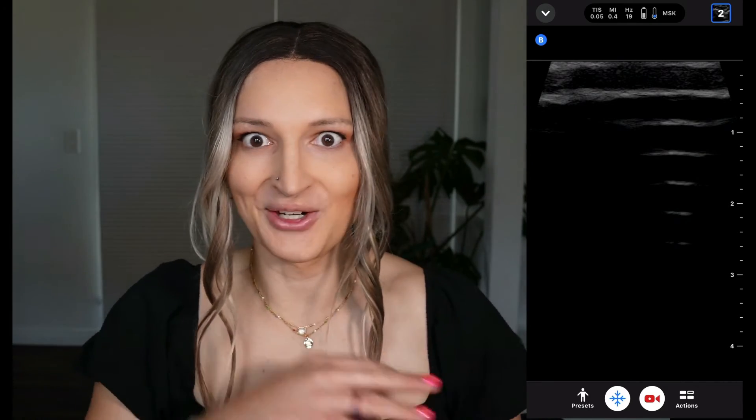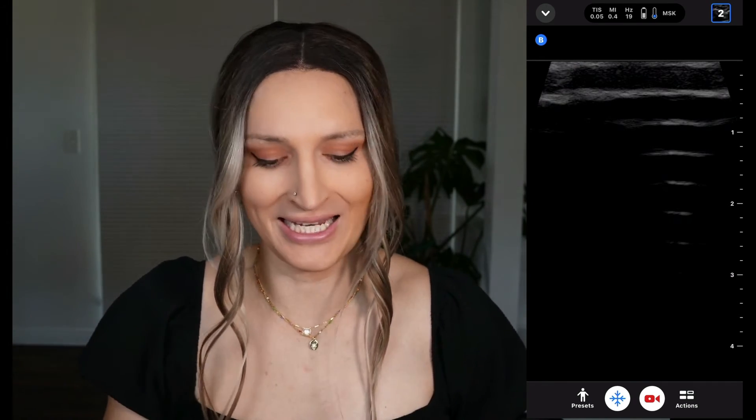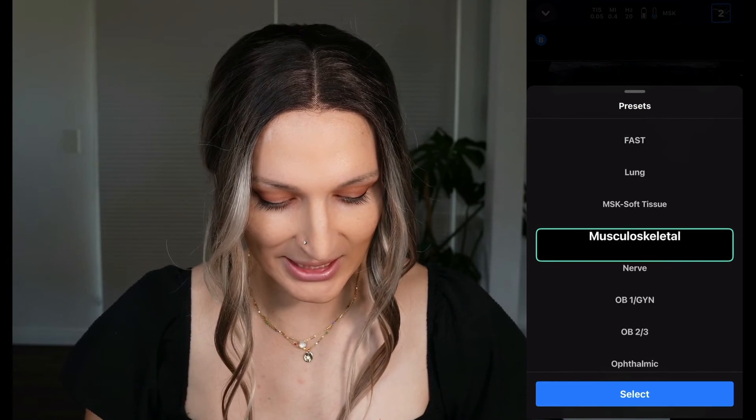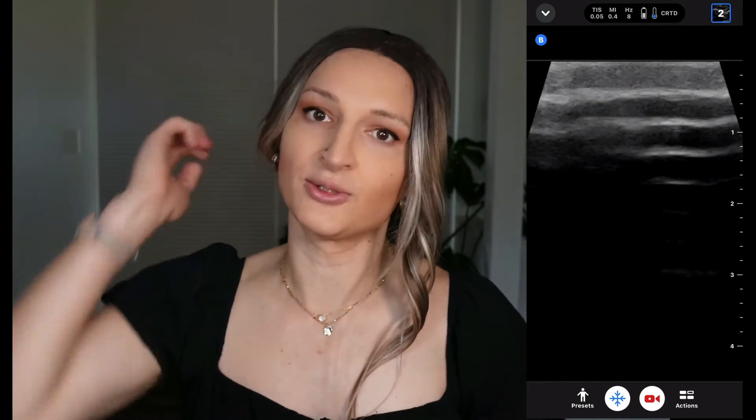It's always a little tricky to scan your arm when you have a camera going. So I wanted to show you some other settings. The app itself works essentially the same. We'll go to presets and let's go to vascular — let's do carotid.